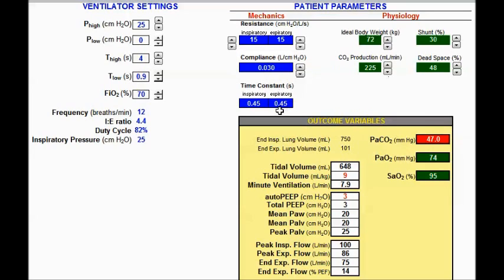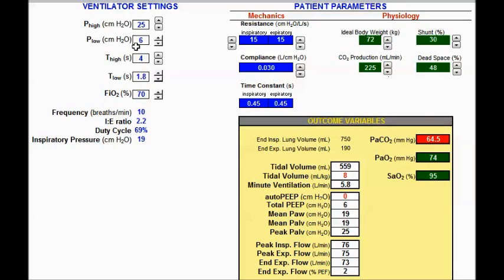Changing compliance to 30: the expiratory time constant is now 0.45 seconds. Multiplying by four gives 1.8 seconds, so I'm setting t-low to 1.8 seconds. Tidal volume is now 10 cc/kg — there is no auto-PEEP, but this is not lung protective. So I need to increase p-low a little to decrease that tidal volume. Continuing to increase p-low while evaluating tidal volume, it comes down into the safe range of 6 cc/kg — within the 4 to 6 range.